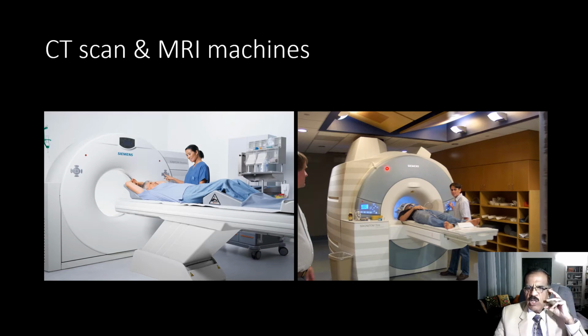MRI is generally speaking more sophisticated, more expensive, and the latest, and the CT scan is relatively cheaper and has been in the market for a longer period.